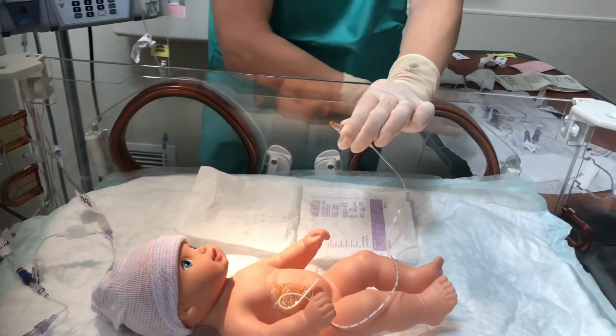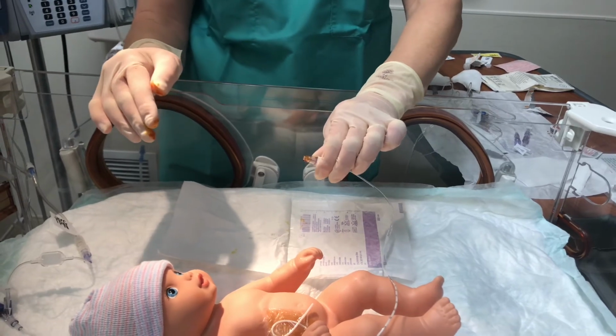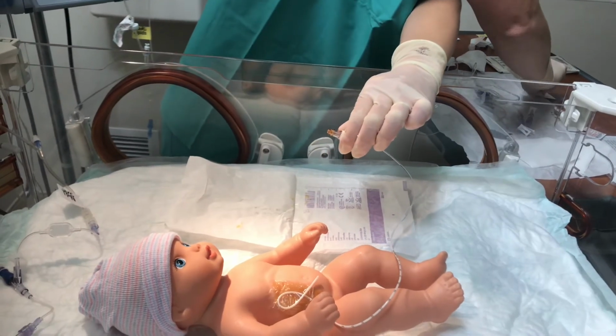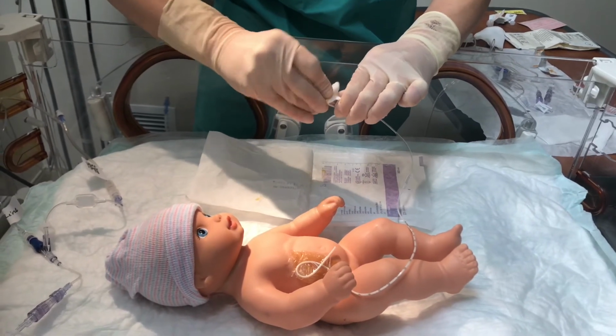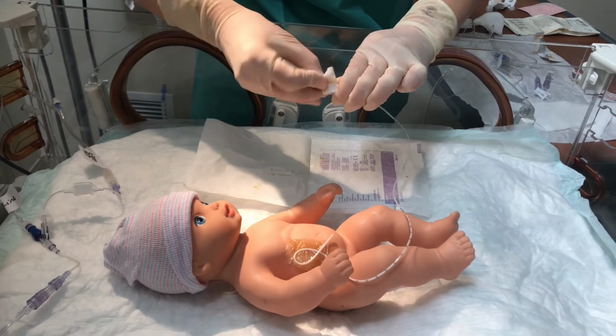And then we're going to allow a dry time of 3 minutes. Okay, so we'll watch our clock while we're doing that, and we're going to allow 3 minutes. When that 3 minutes is up, we're going to vigorously scrub the same clave now with alcohol for 15 seconds. And then we're going to allow that to dry.